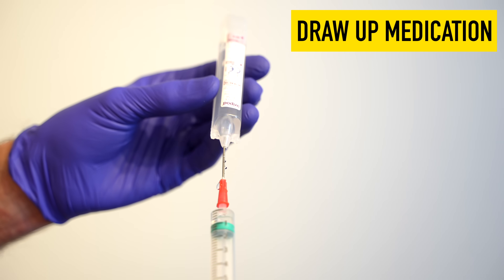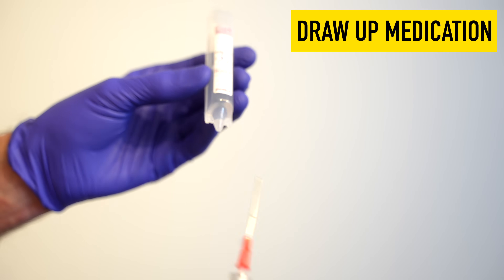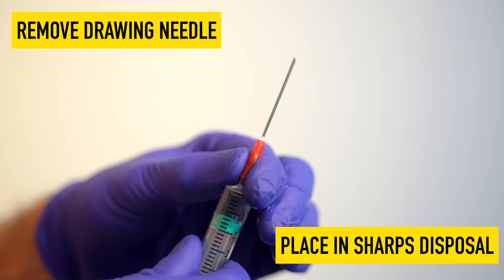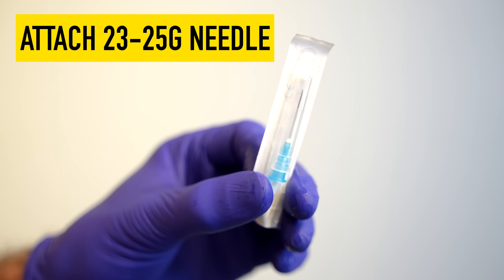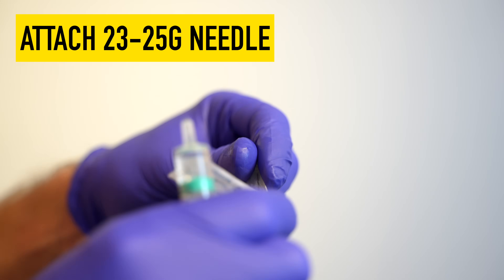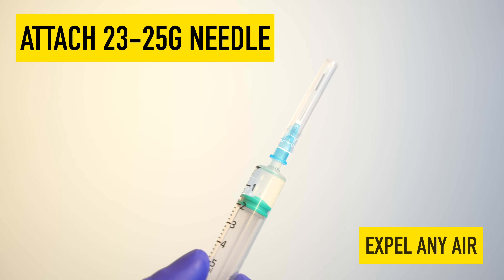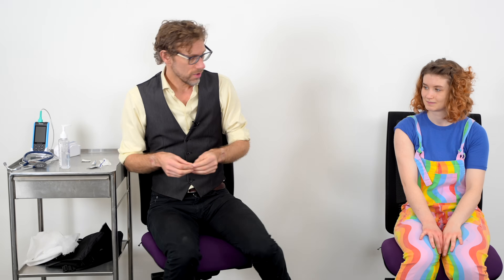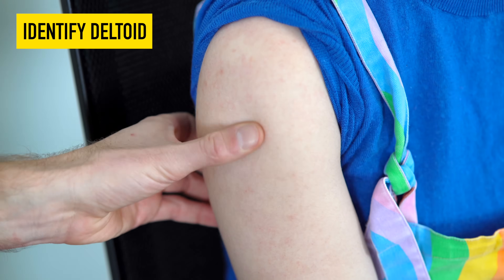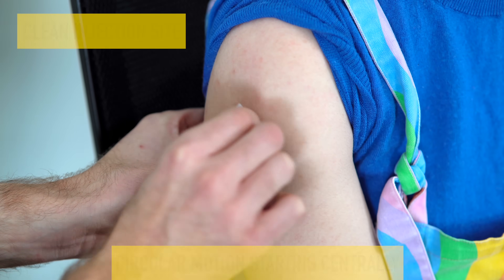So I'm going to take a look at it. I'm just going to start off with an alcohol swab, checking where the top of the acromion is, and going round and getting wider.